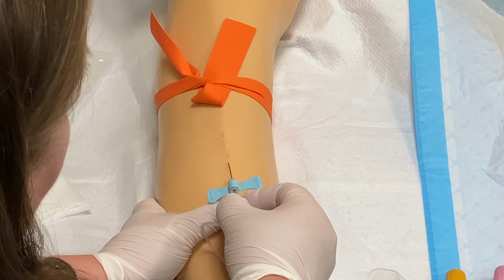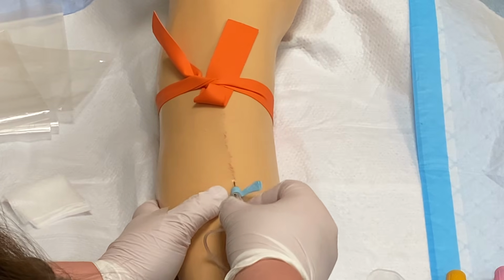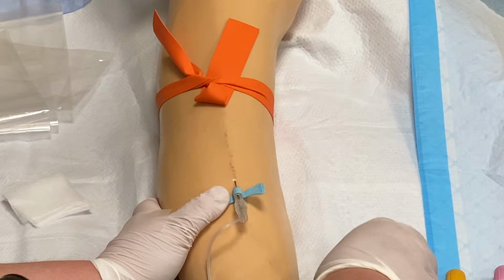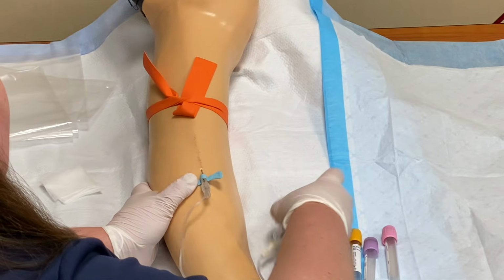I'm gonna line the needle up with the vein, insert it at a 15 to 30 degree angle, and then when I see flash come back in the chamber, I'm gonna anchor the wing with my thumb that was anchoring the vein. My first tube in the order of the draw is blue, but I wanna make sure that my blue tube doesn't have any air in it.